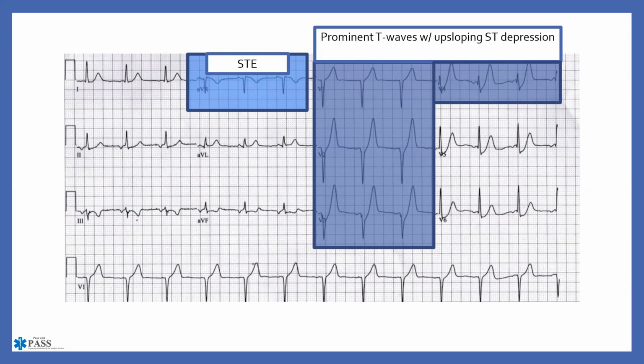If you look at this under normal conditions, if you all made a run today and saw this, yeah, it may look a little funky, but probably what a lot of people would think is, well, maybe it's a potassium thing, because we always talk about hyperkalemia and tall tented T waves. Well, remember, the evolution of an AMI, or an acute myocardial infarction, is a hyperacute T wave. So don't get caught thinking, oh, maybe it's a potassium thing, and send these people packing, or tell them they don't need to go to the hospital, when in fact they are having an infarction pattern. So please be careful with that.